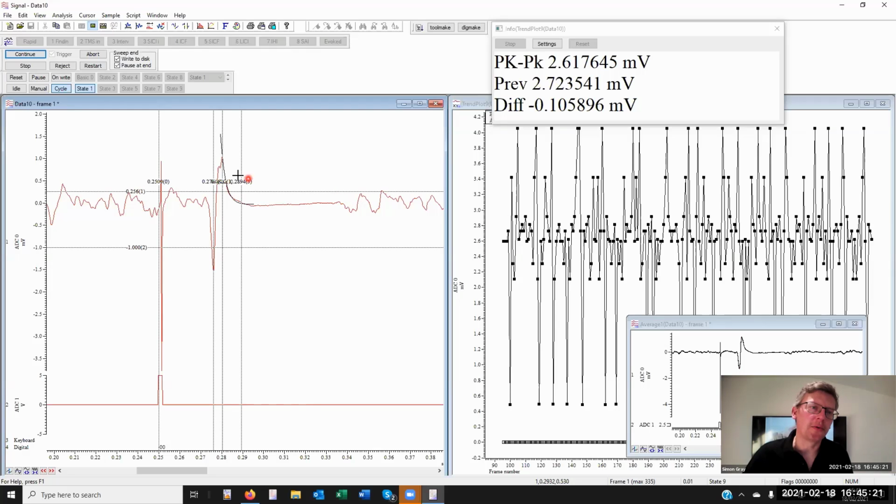and then ask them to work left and another to work right, looking for when the data falls into the upper or lower cursor, if set to the same values, -2 for the standard deviation, by the way, or falls out of it, and that would give us a duration of silent period. Now here we might argue that that isn't the end of the silent period because we've just got 1 or 2 data points out.